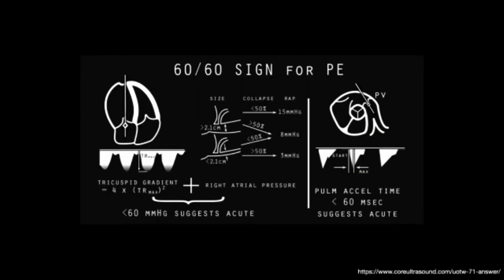On the right-hand side of your screen, you see the Doppler beam going down the pulmonary valve. To the left side of the screen, adjacent to the aortic valve, is the tricuspid valve. Now what you do is, instead of using the pulse wave Doppler, you pick up continuous wave Doppler and point it down the tricuspid valve. That's your first view in which you start picking up the tricuspid velocity, and oftentimes that is where you find the highest velocity, okay?